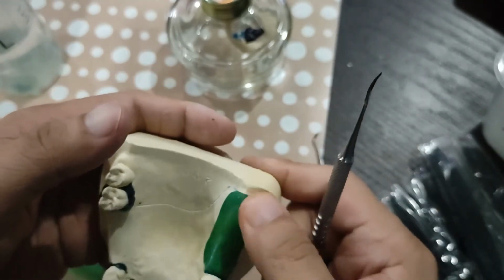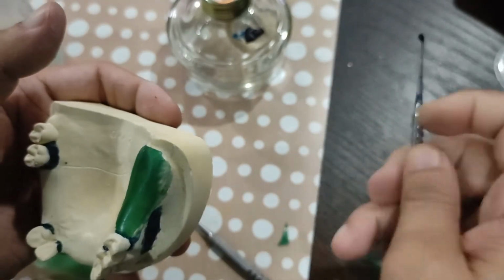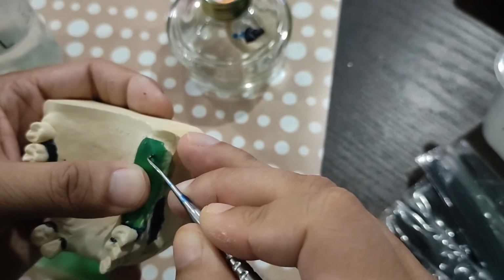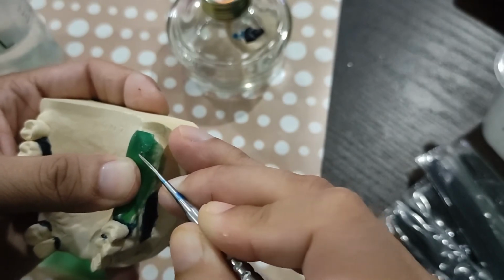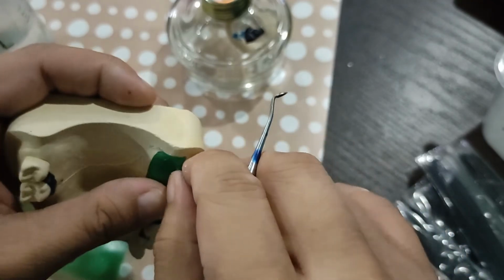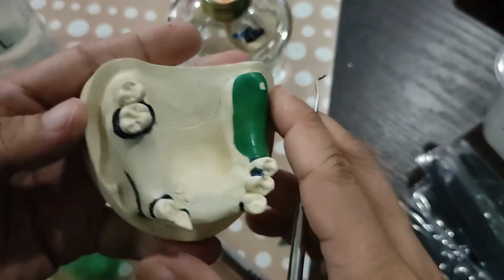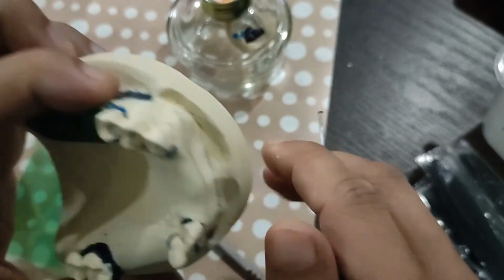Alright, and then you place tissue stop. Alright, so I'll do that for the rest of the cast.